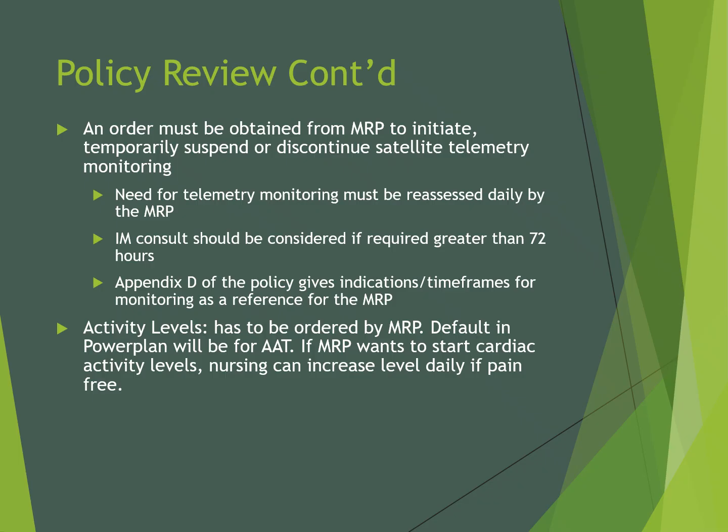Appendix D of the policy gives indications and timeframes for monitoring as a reference for the MRP. And as part of the power plan, activity levels will be activity as tolerated, pre-selected. If the MRP wants to start cardiac activity levels, nursing can increase the level daily if pain-free.